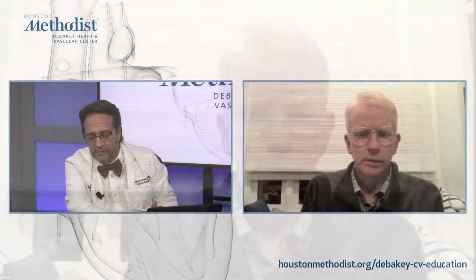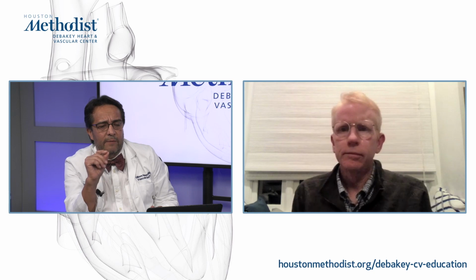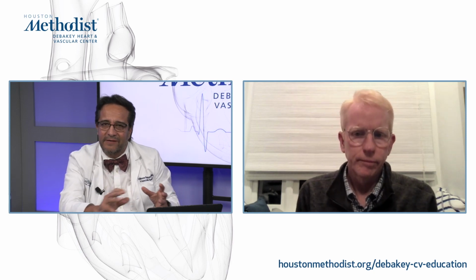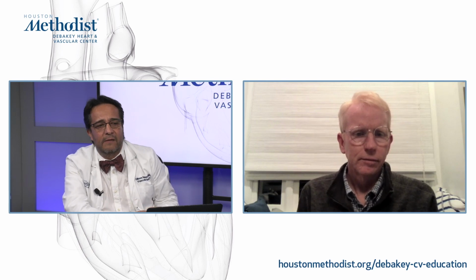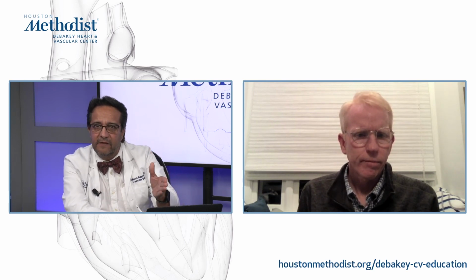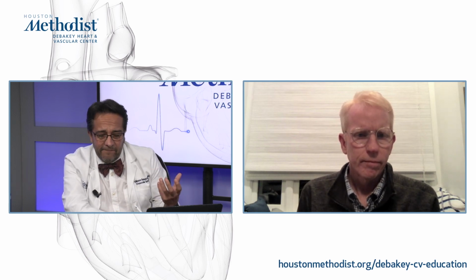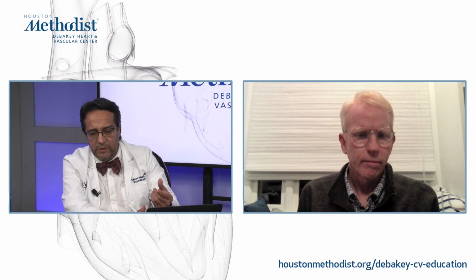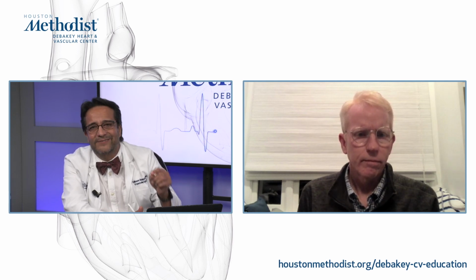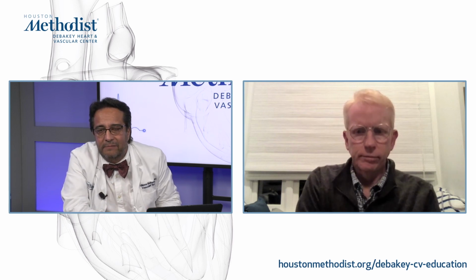Of course, absolutely. Lastly, because we are running out of time, what do you think about perforators? They are iffy, right? You mentioned it. Sometimes there is not really a protocol or randomized trial that said, this is the diameter, this is the velocity, period. There is no such thing. But what I follow, I don't know what you think about this, is when you have a perforator, obviously more than 3.5 millimeters or 4, that is right under the ulcer, with something that is causing trouble.